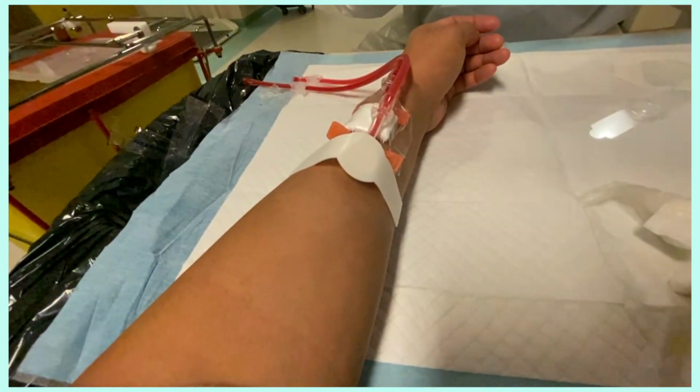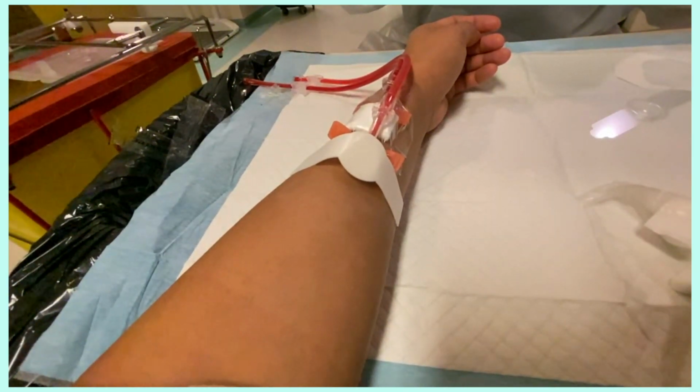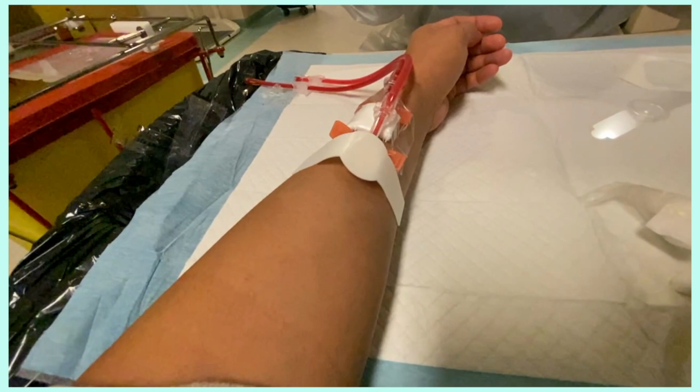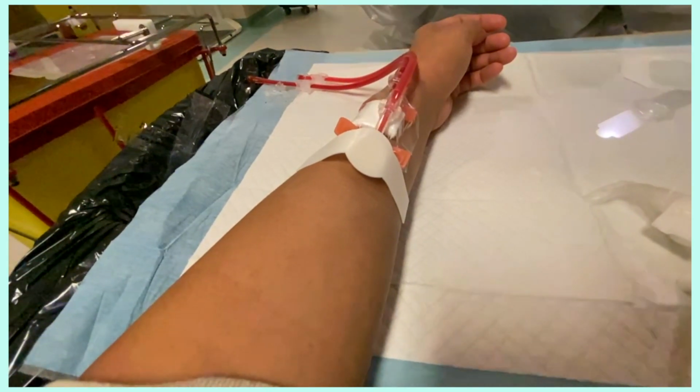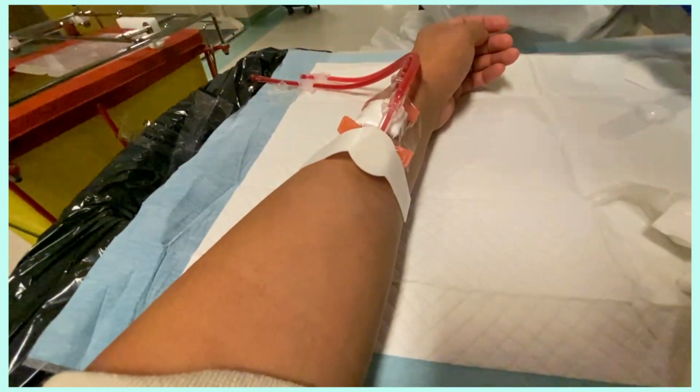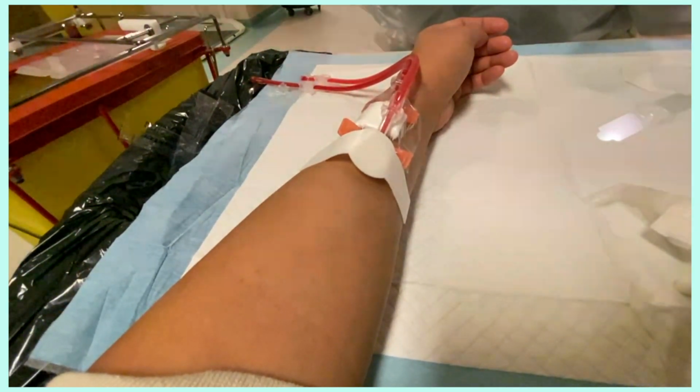So this white thing that's on top of the exit site of the needle, I call it a stopper, and what it does is just stop the blood from coming out after they take the needle out. So yeah, that's why I call it a stopper. And it's basically your first line of defense.